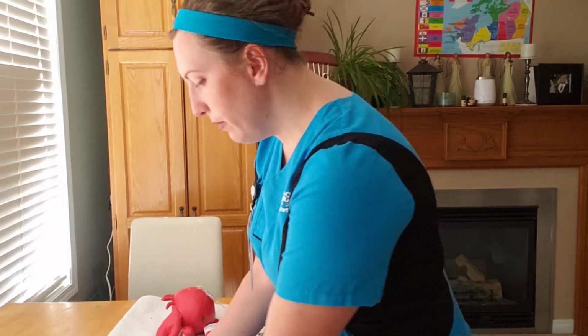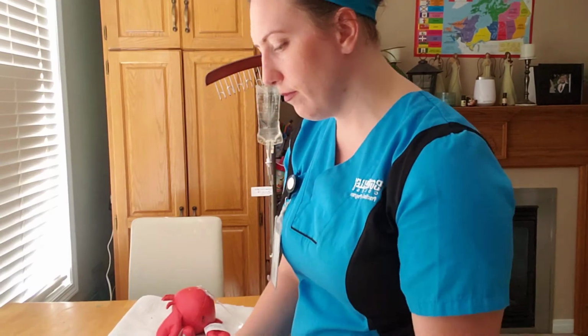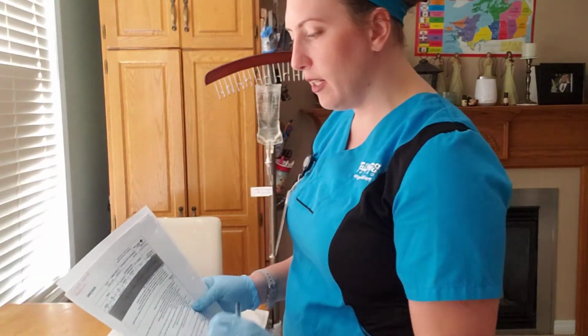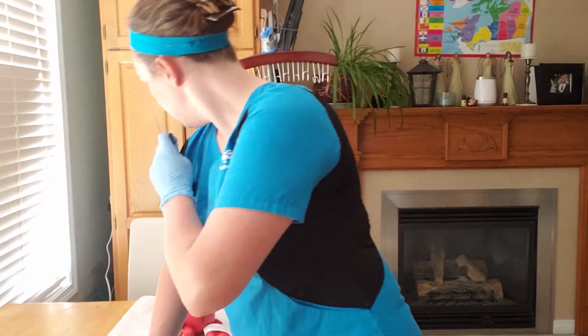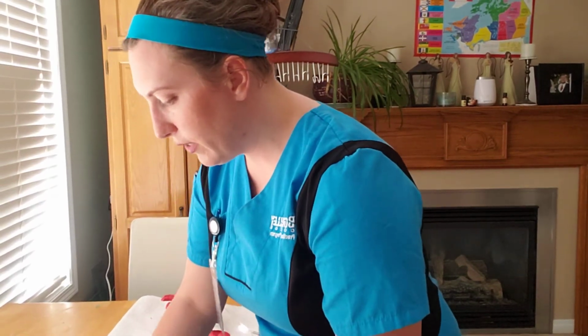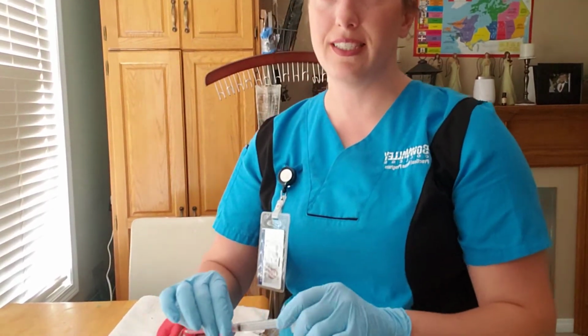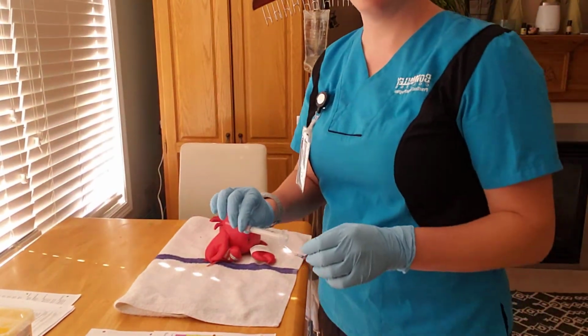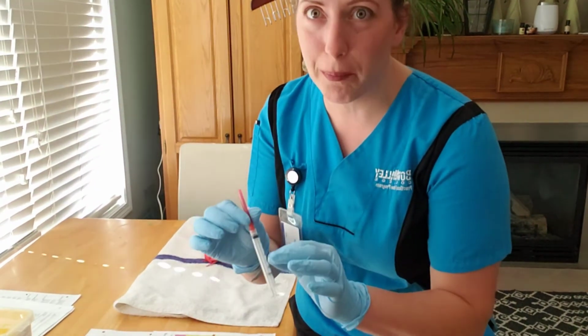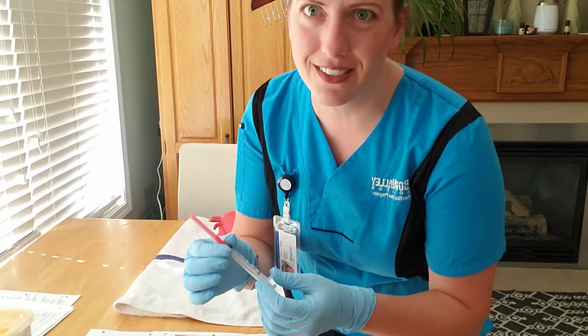So now what I'm going to do, I checked my monograph and I've pulled my mini bag based on the monograph. I'd like you to visualize that this came out of its sterile packaging. I just ran out of supplies through my practicing.